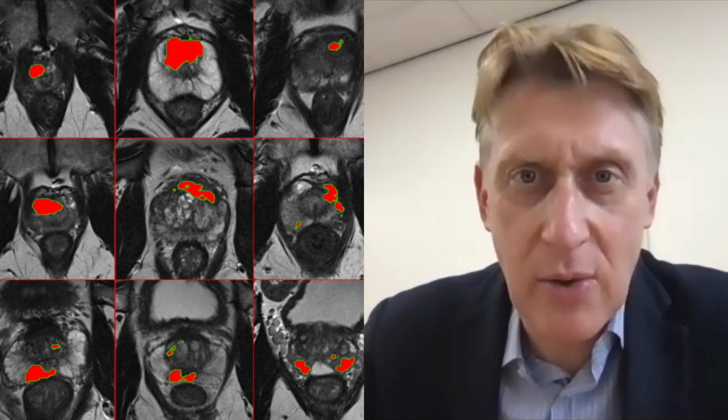And if we had algorithms that interpreted the MR and took the time pressure off the radiologist, we could potentially move towards a situation where, rather like with the RAPID study, we could see a patient after their MRI, and for those that required a biopsy, we'd very quickly have a report, signed off by a radiologist, but without the normal time taken to interpret the scans and come up with a report and a plan for biopsy. The other thing is that having a very detailed, annotated report with visual aids as to where any lesions are within the prostate gland is also very useful.